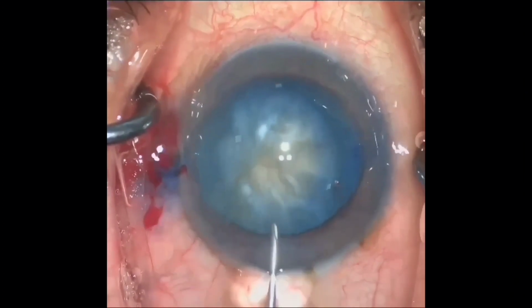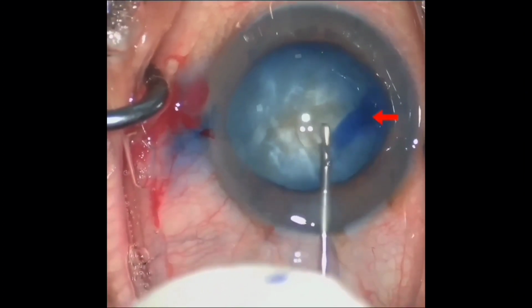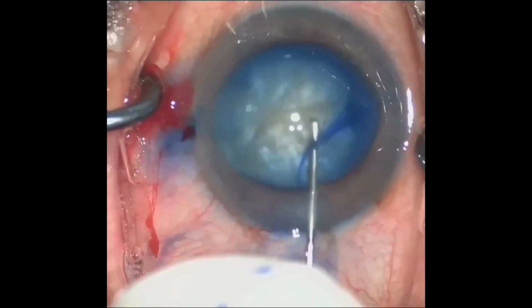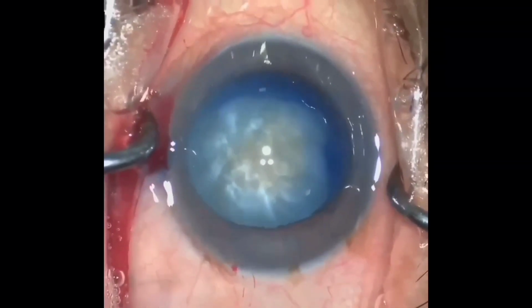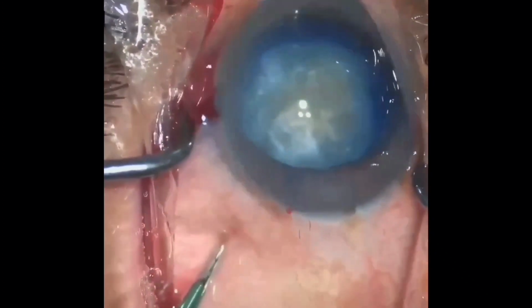As in a normal case, capsular rhexis was started, but peripheral extension was noted due to the positive pressure, with escape of fluid from behind the iris again and shallowing of the anterior chamber. To relieve this positive pressure and to deepen the anterior chamber, a 23 gauge sclerotomy port was placed 4 mm behind the limbus.